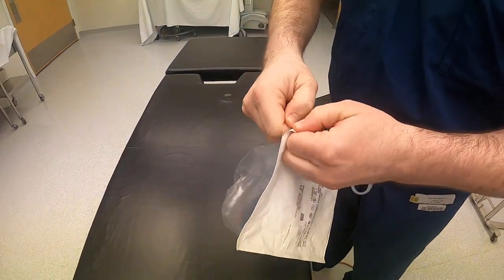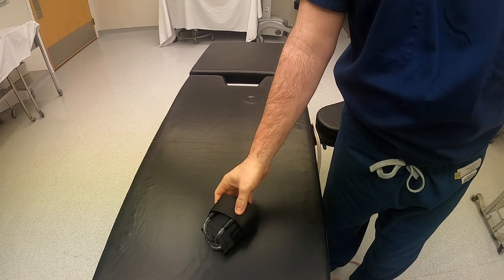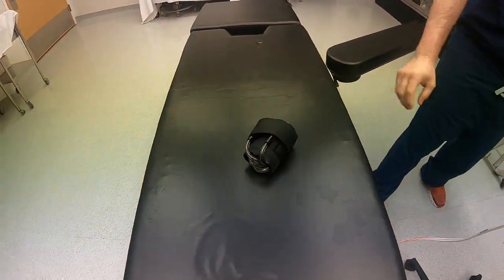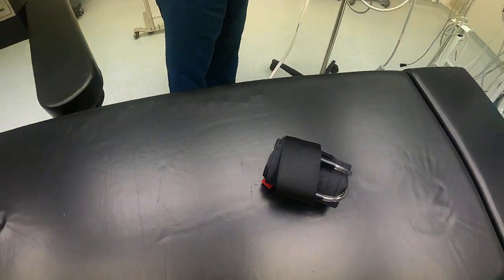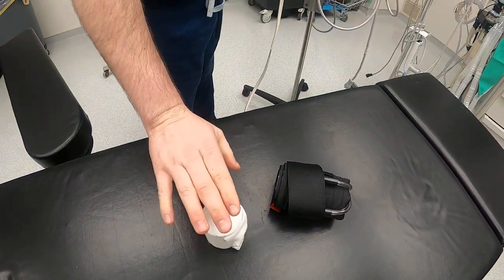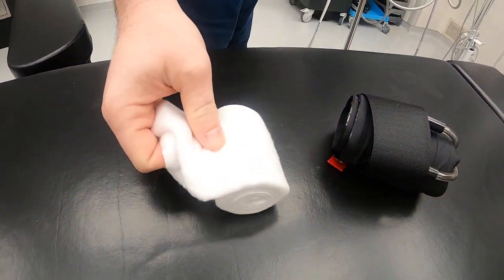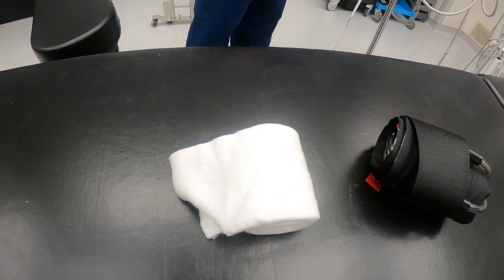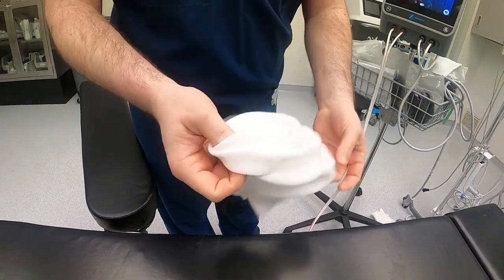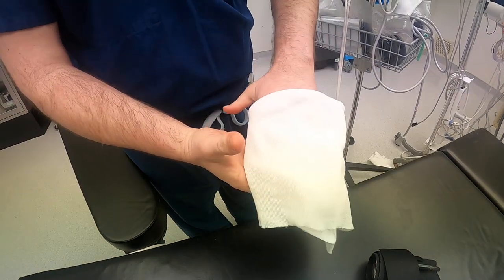The tourniquet is currently sterile, but when put on the patient it's usually not sterile, so you can open and prep it once everyone agrees on the size. There are two different ways to protect the skin under the tourniquet: cast padding, which is soft and fluffy, and a stockinette, which slides over the body part before the tourniquet goes on top.